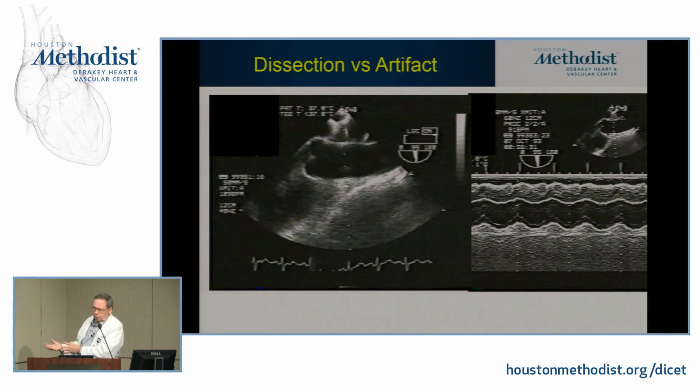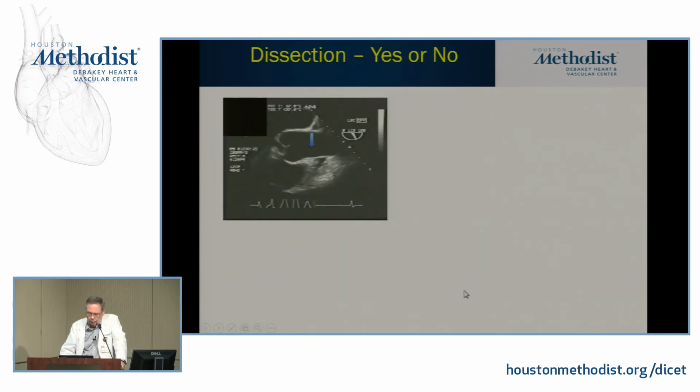I mean, there's many other things you can do. But one quick maneuver is just to throw an M-mode there and show that it's moving parallel, whereas the flap has a whole different ballgame. Look at this one.